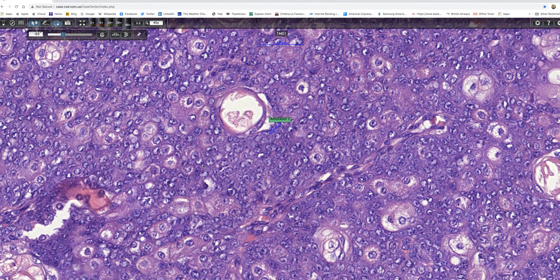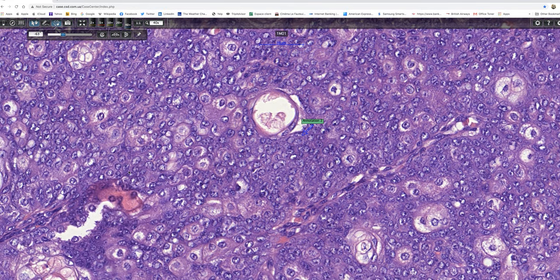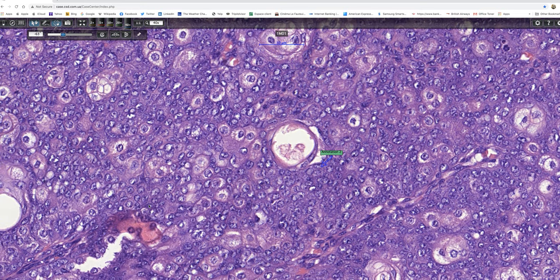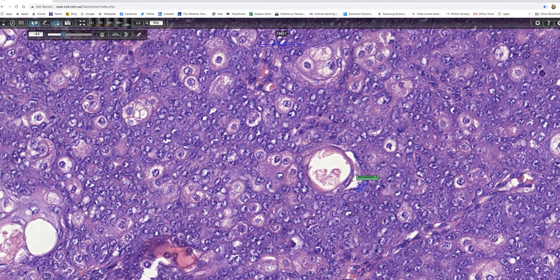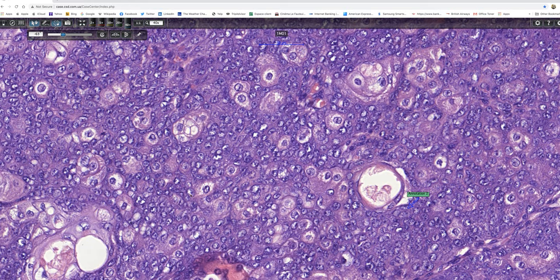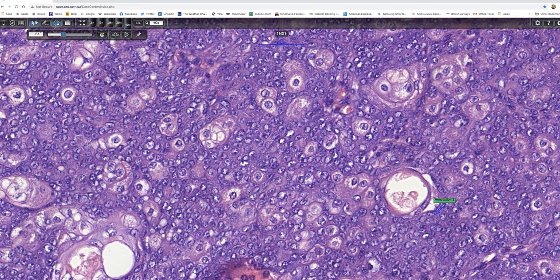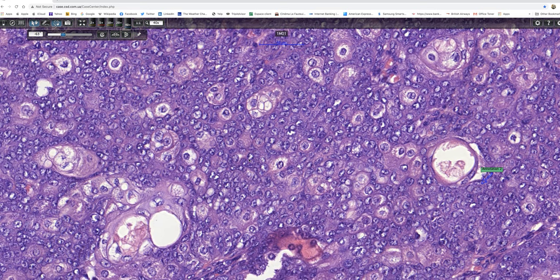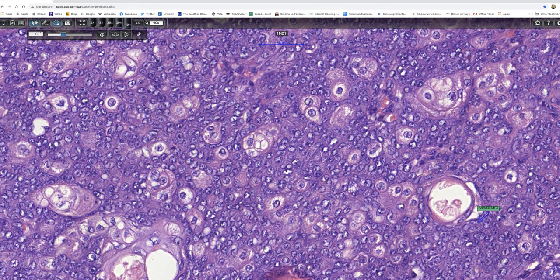Here we're picking up large nuclei. In comparison to the earlier ones, they're three or four times the size. And there's one with two nuclei. The nucleoli are generally quite conspicuous. So I think we're beginning to see some pleomorphism.